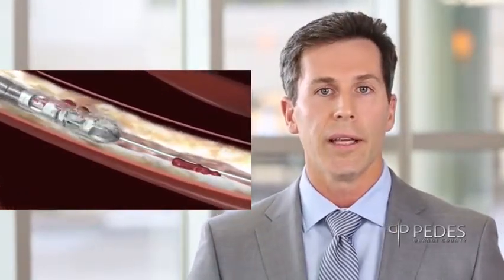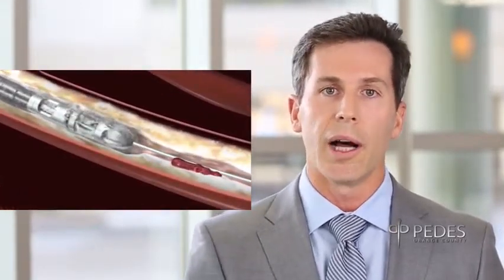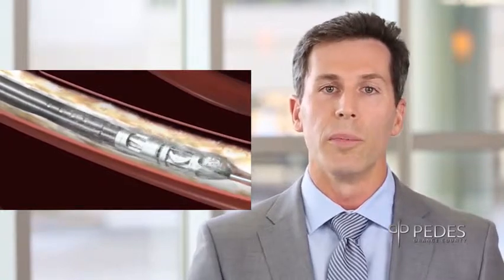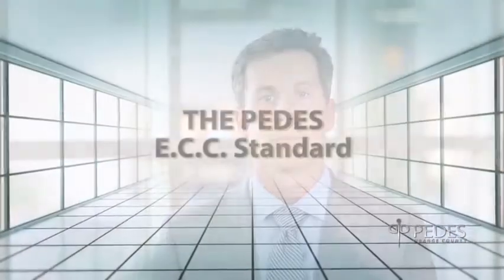If we identify a significant blockage that's impeding the blood flow to your leg, we're going to take a small catheter-like device and position it in the blockage so that we can actually remove the blockage from the artery. This is going to restore the normal blood flow to your leg. Once we're done, you'll spend another 2 or 3 hours with us in our center. You'll then go home the same day.